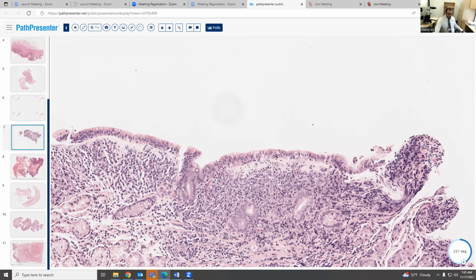So we say there is collagenous colitis. You can do trichrome to highlight the collagen in the subepithelium, and usually it's thick. You should be careful, because sometimes you can see a normal little bit of collagen or a pinkish area. Just don't call this collagenous colitis. It should look very thick, and you should do trichrome to diagnose collagenous colitis.